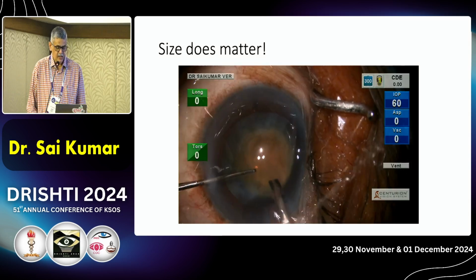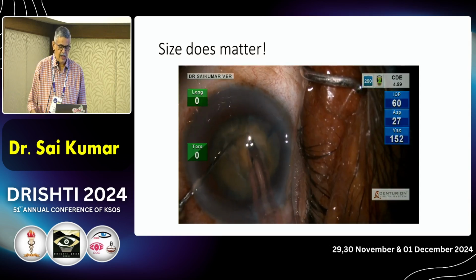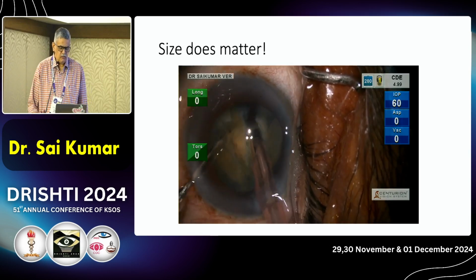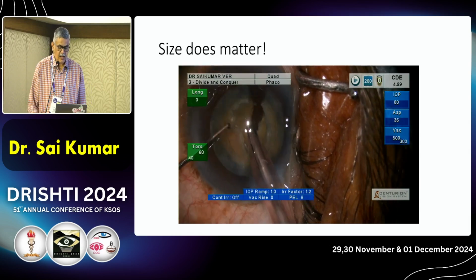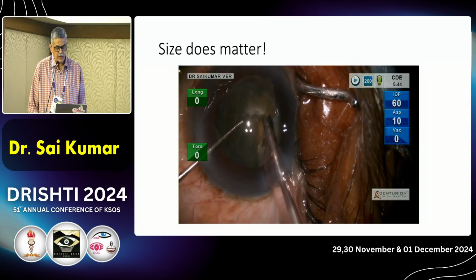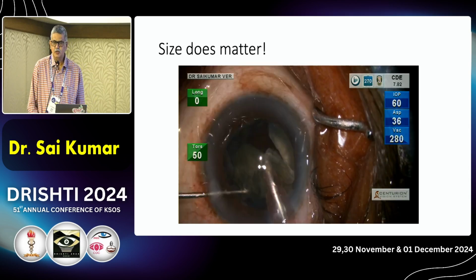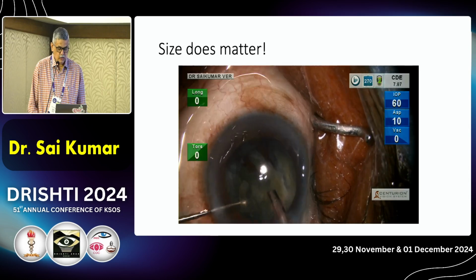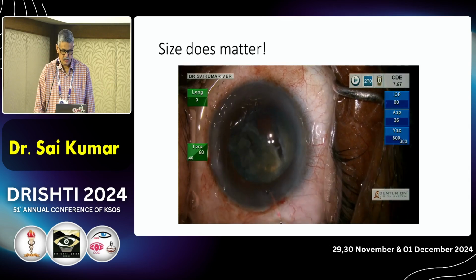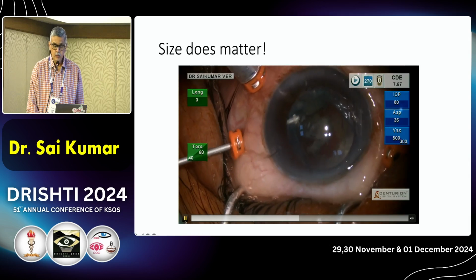I've gone in just like my routine phaco, but here I had this ominous feeling that I'm going to break this capsule. This is a very hard cataract, so I tried to make a crack and there it goes. So there you have the rent. I am trying to retrieve at least one part of it so that my VR surgeon has less job to do. But most of the nucleus has dropped into the vitreous. So when you have this situation, please don't meddle with the piece.